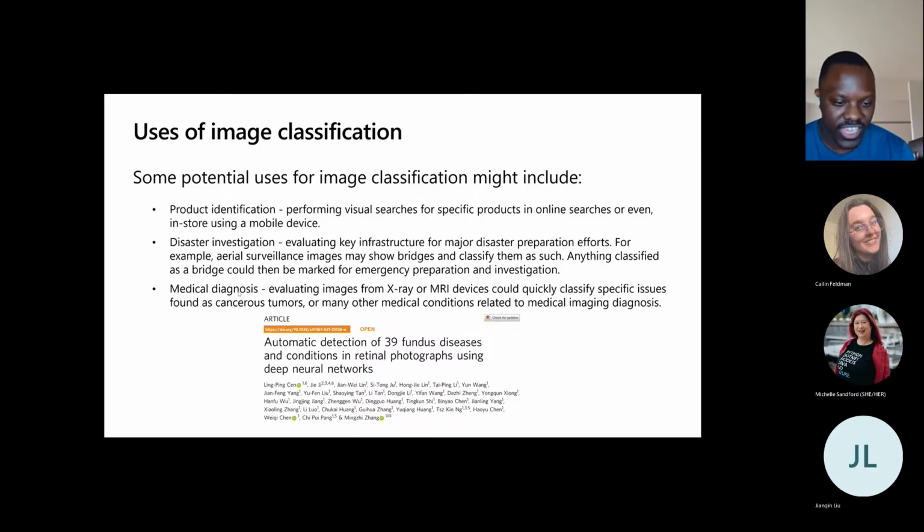And that's one aspect. The key one for us, which we're looking at, is medical diagnosis. This is a really growing field. In fact, what we're going to attempt today is based on this paper. There's a DOI. Perhaps I should put a link on it. It's a 2021 paper published in Nature, and it's about detection of fundus diseases using deep neural networks. So the data set you're going to use is actually based on theirs. We're looking at diabetic retinopathy, but there are other diseases that fall under a similar category, and they investigated them all. So it's very relevant at this time.